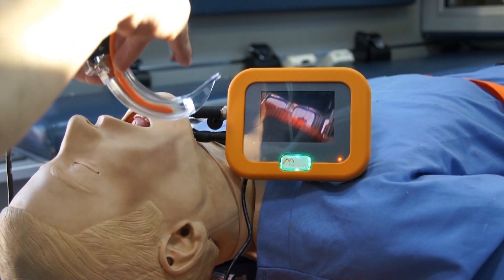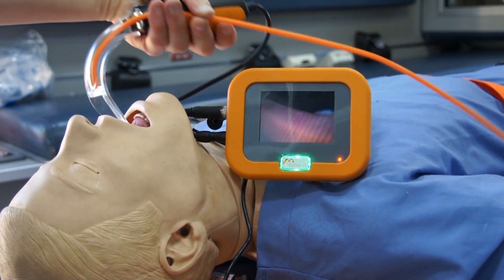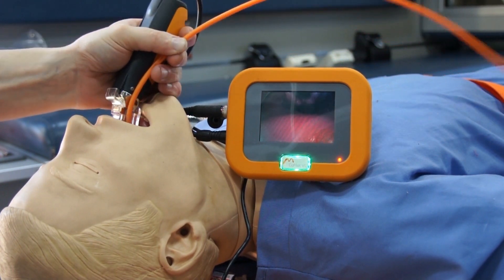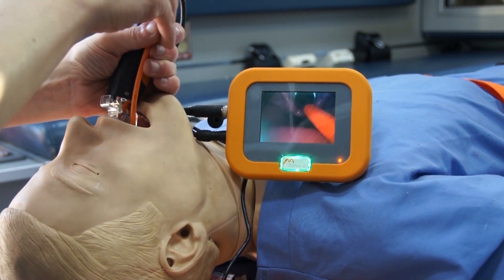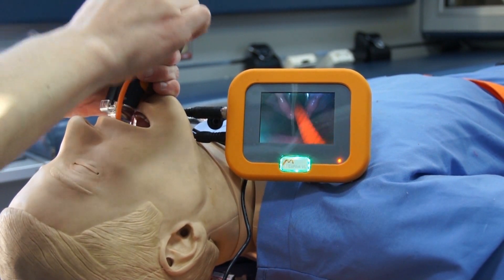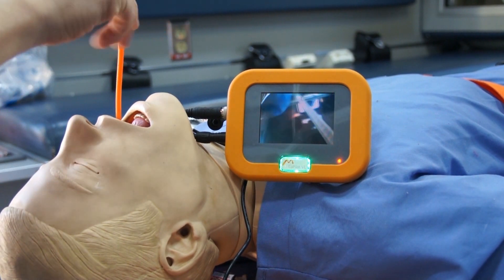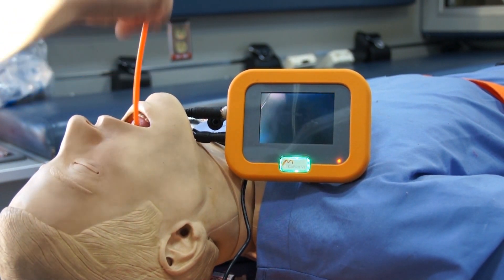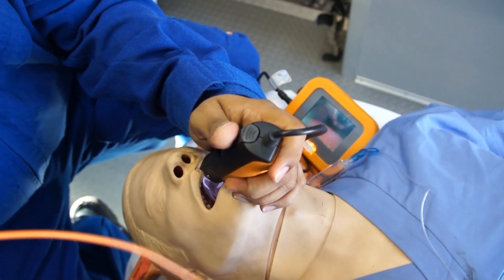You start by preloading your bougie and just drop it in to get a view like that. Advance it forward — notice there's no lifting of any anatomy. Wow, that is really nice.